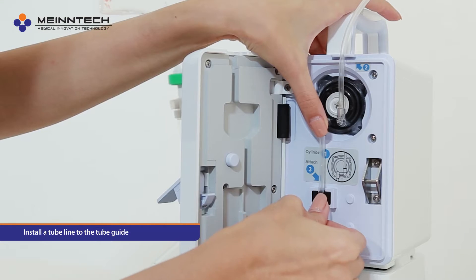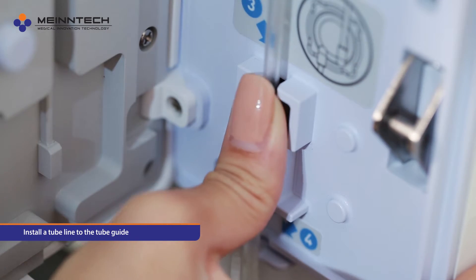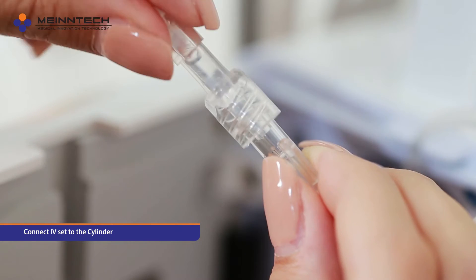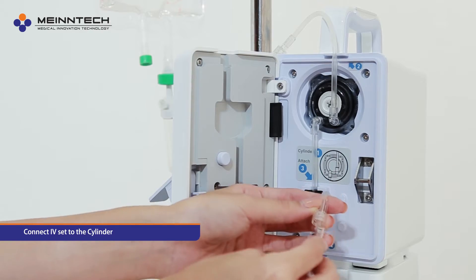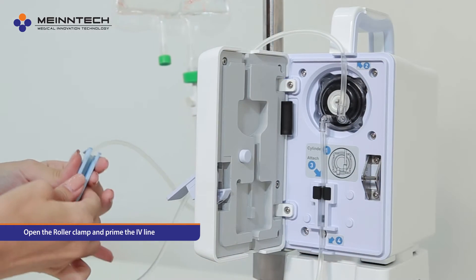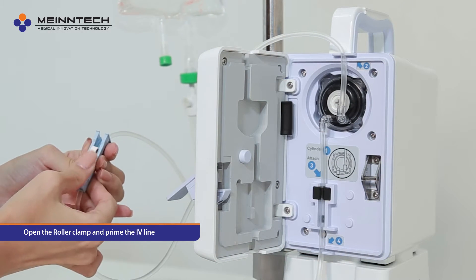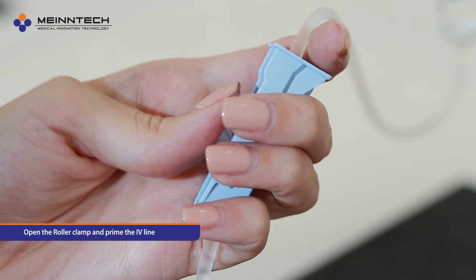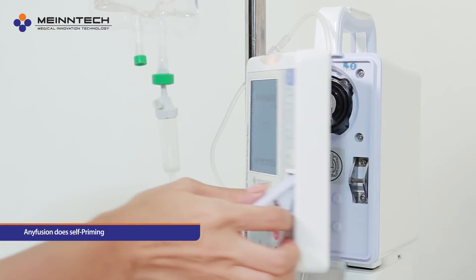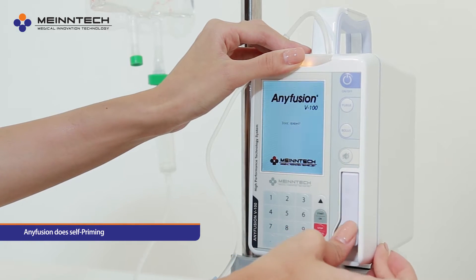Install a tube line to the tube guide. Connect the IV set to the cylinder. Open the roller clamp and prime the IV line. Close the door and Anyfusion performs self-priming.